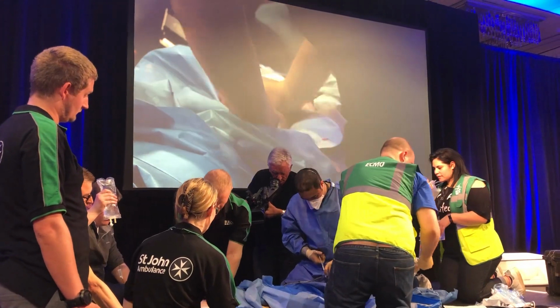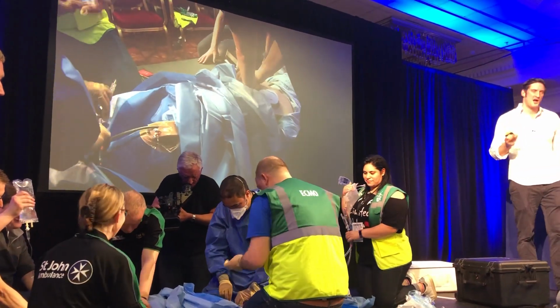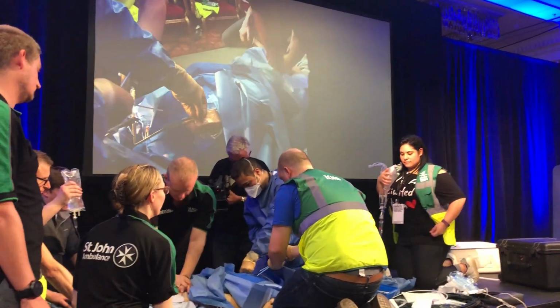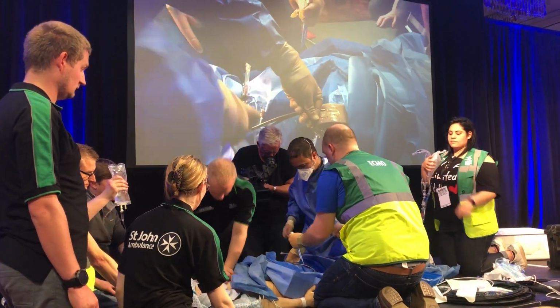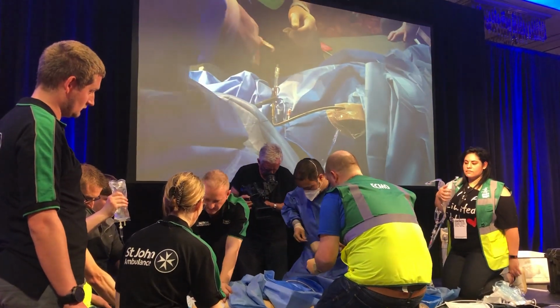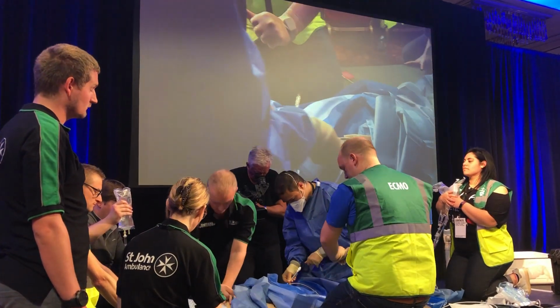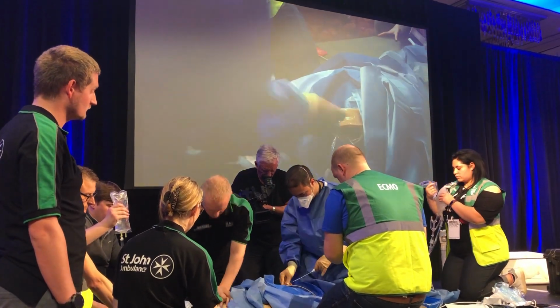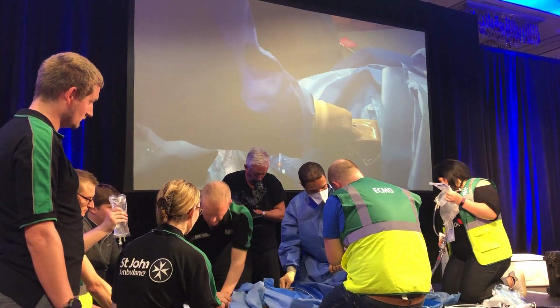And really interestingly, if you're interested in infection control, which I'm not, but if you are, we have patients that have big pipes put in very quickly in not ideal situations, who have those big pipes for months. We have hardly ever got an infection from an ECMO cannula. Now that may be because the flows of the blood are quite fast, but there are still venous cannulas sitting in groins and necks, sometimes for months. It's just quite interesting when we see peripheral cannulas getting infected in 3 days, and then we've got these giant things in less than sterile conditions that don't seem to get infection. If I was interested in infection control, I'd be interested.